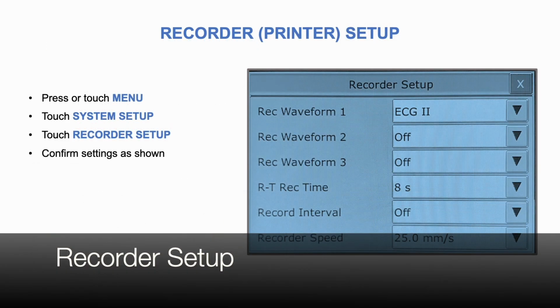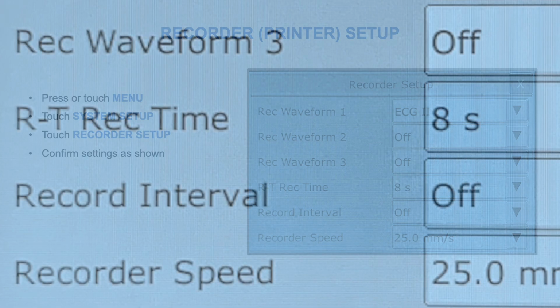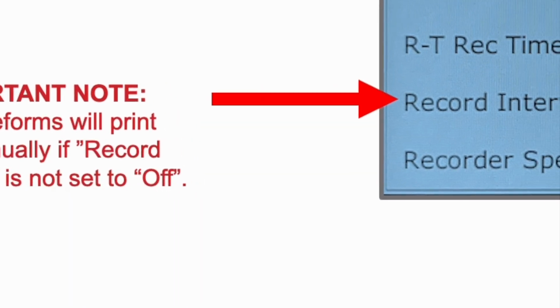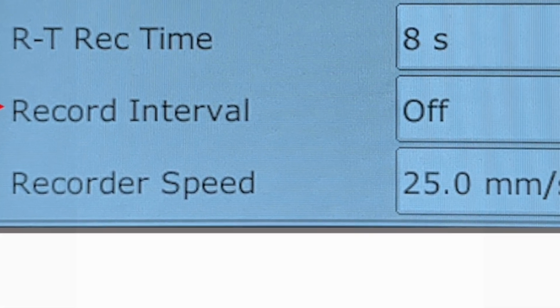Recorder setup. Press or touch Menu, touch System Setup, touch Recorder Setup. Confirm settings as shown. The most important setting is record interval. It should be set to off. Waveforms will print continually if record interval is not set to off.